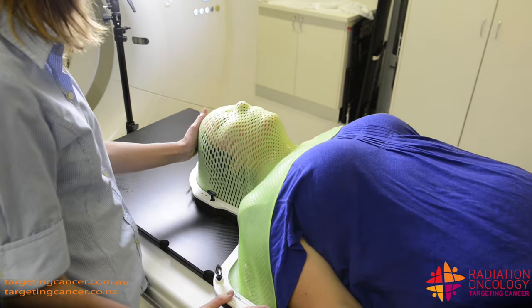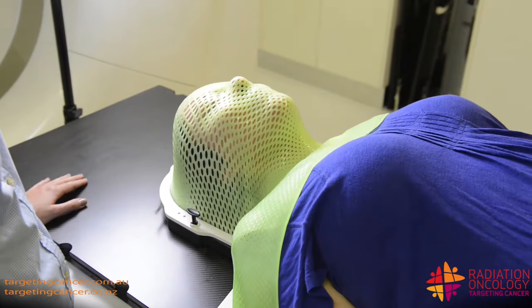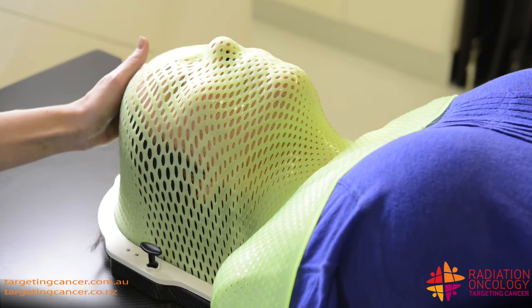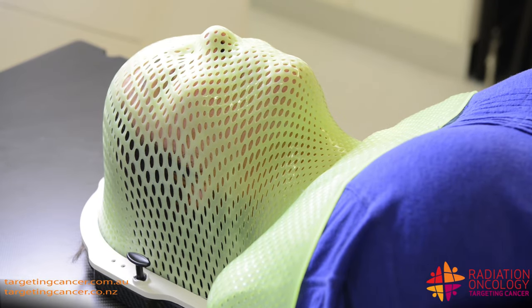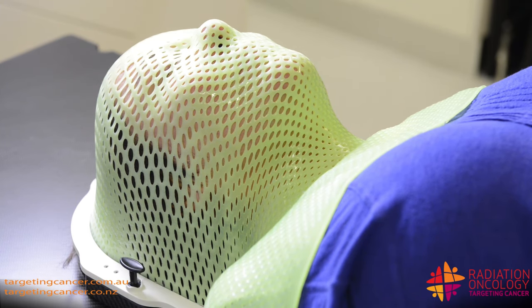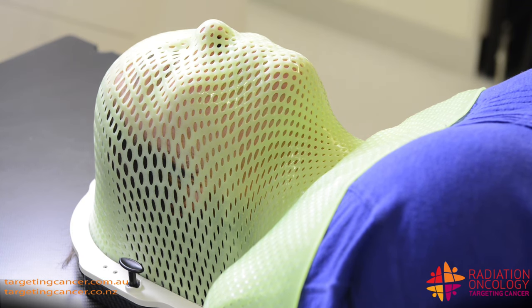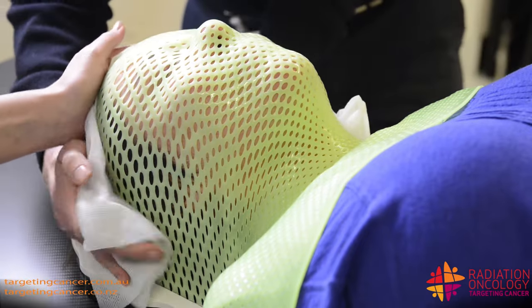Still feeling okay? Yeah, thank you. Starting to get a bit tighter now, which is good. Starting to feel it tighten around your face. So the tighter the better. I'm going to bring over those cold cloths at the moment and help that cooling process. You'll just feel a damp cloth now — that's just to try and help speed up that hardening.